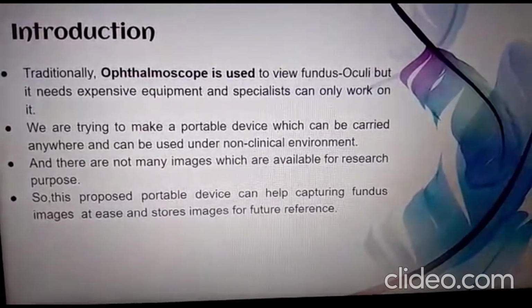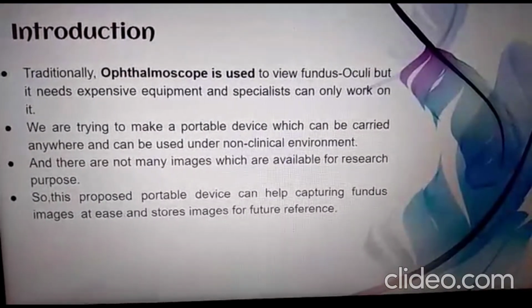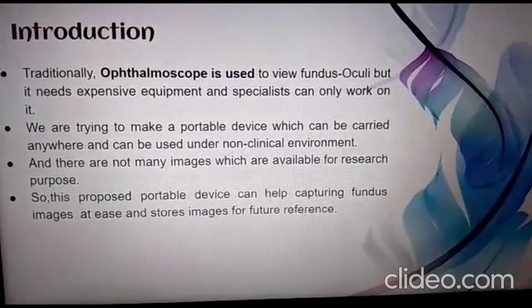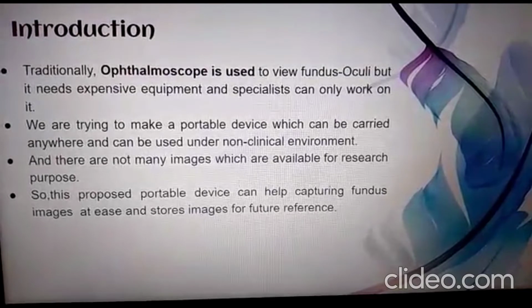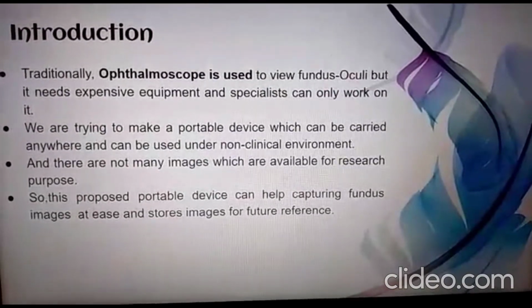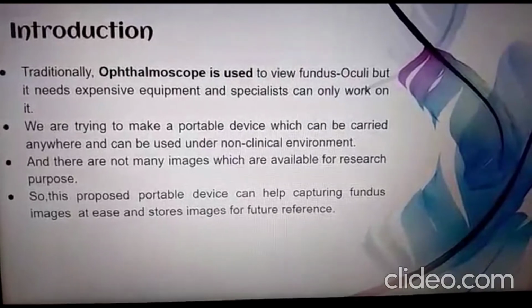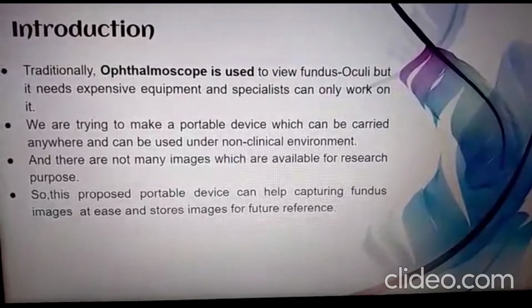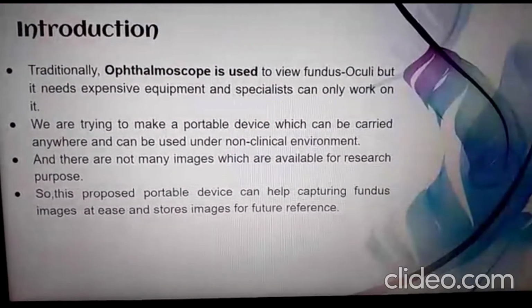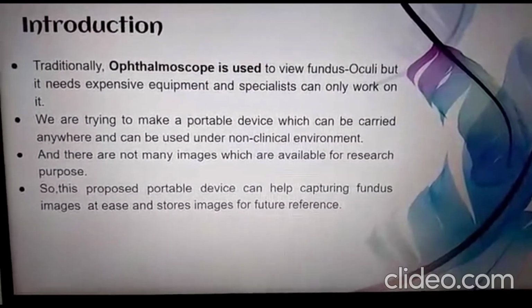So in order to make people in rural areas get examined frequently and at an early stage, we are trying to develop a portable device which can be carried anywhere and can be used in a non-clinical environment, so that early examination of the eyes of people in rural areas can help them get better vision at an early stage.